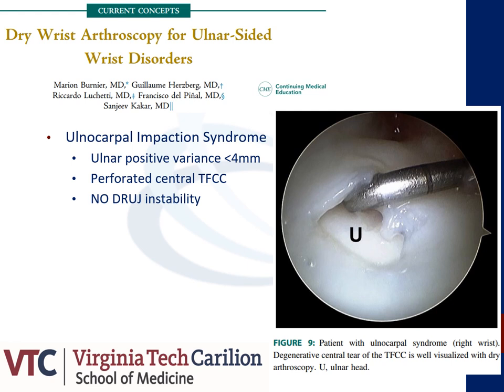In the setting of ulnar positive variants less than 4 mm, it is recommended that the patient undergo a simultaneous arthroscopic wafer procedure. When performing this procedure utilizing dry arthroscopy, surgeons can use a larger portal and therefore a larger bur to perform the resection in a more expedient fashion. The surgeon needs to pronate and supinate the radius around the ulna when performing the wafer resection to ensure appropriate contouring. It is recommended that the automated washout technique be utilized, placing a 10-milliliter syringe of saline on the arthroscope to remove debris from the ulnocarpal joint and prevent overheating of the instruments.